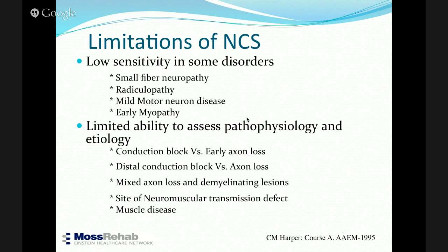You may have, in severe or late motor neuron disease or myopathy, a decrease in amplitude, but it doesn't tell you that that is the pathology. However, what it tells you is that there is some pathology, and then you have to go back and look at what the pathology may be, looking at different studies.